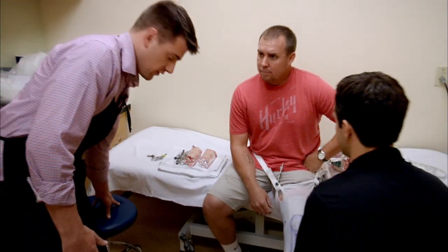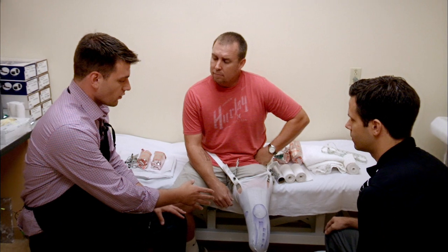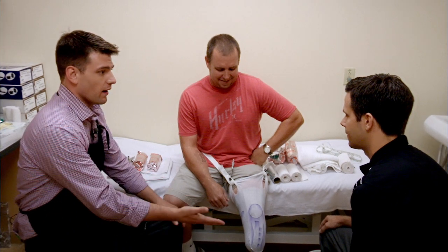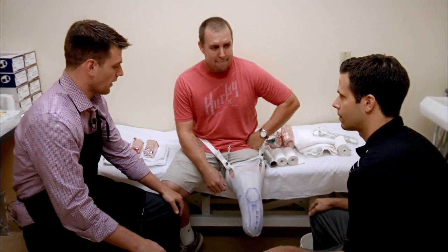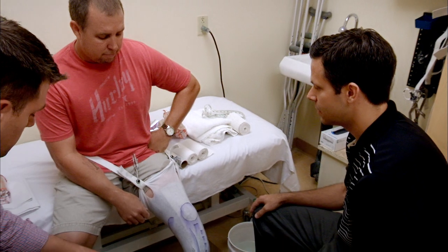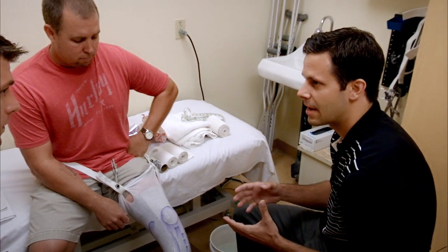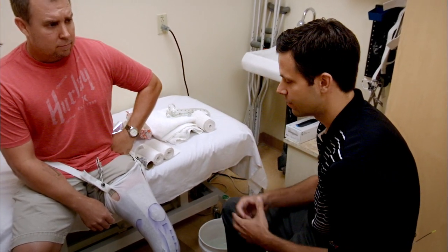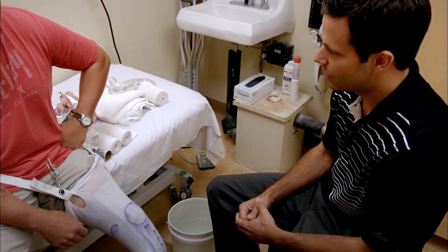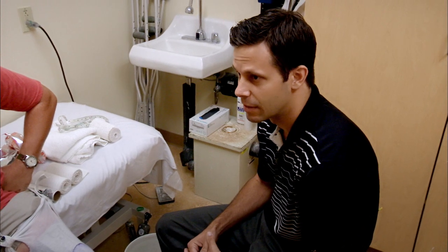Brian's here with Nate Jackson, one of the prosthetic technicians here who helps wounded warriors every day. We just came from the sewing room and now we're going to be doing a cast on Nate, and he's agreed to let me do it. Hopefully it goes better than the sewing, but Brian's going to first give me a quick lesson. We've set Nate up using the sock that you sewed earlier and marked out all the bony prominences, which will transfer over to the mold. We're going to take a cast that we will remove — that will be the negative — which we will later fill with plaster to have a positive mold of his limb. We use plaster to wrap and what we're trying to do is get the volume as well as shape the limb a little bit.